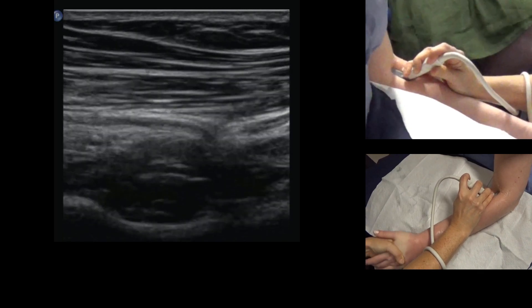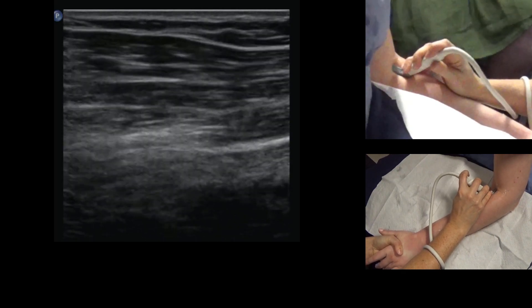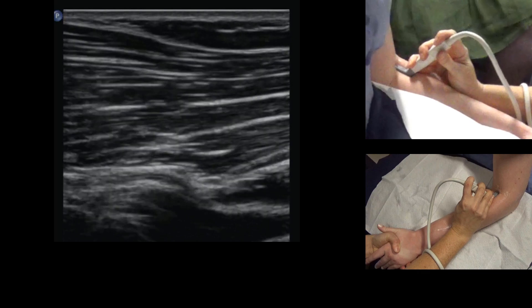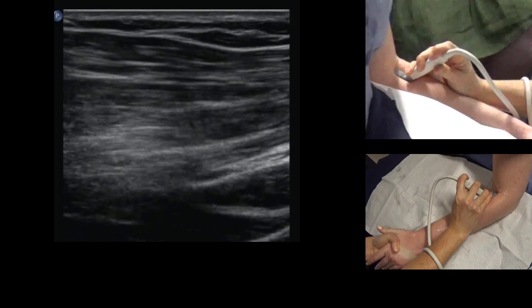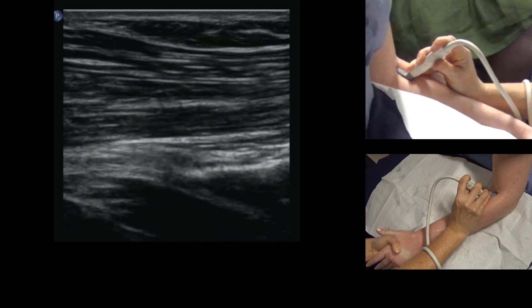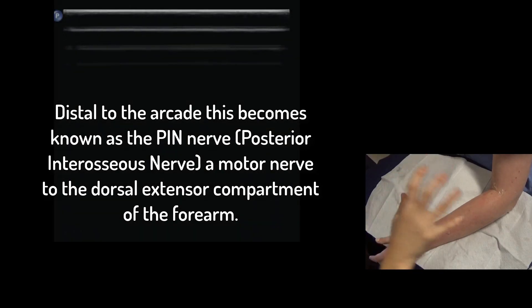Now I'm going to get you to try and supinate back up from this position and I'm going to resist you, but I've just got to find the nerve first. Naturally it kinks a bit when you — okay, ready. Can you see how it goes S-shaped when they're supinating? So you imagine jobs where you're constantly supinating forcefully, what effect that would have after years and years of jamming that nerve. Think about your patient's profession, get them to demonstrate exactly what they do, and you'll work out the people where you really should do that assessment.